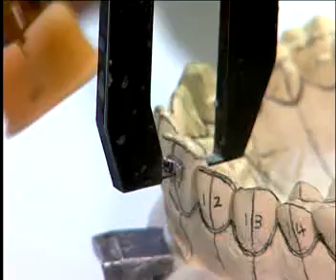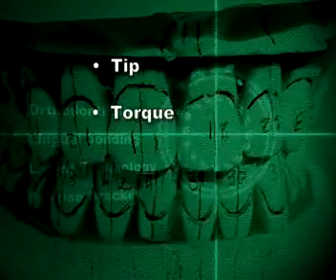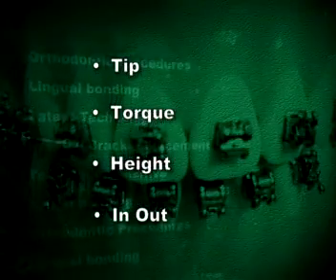The laboratory then positions the brackets on the malocluded model using the diagnostic setup as the prescription for tip, torque, height and in-out.